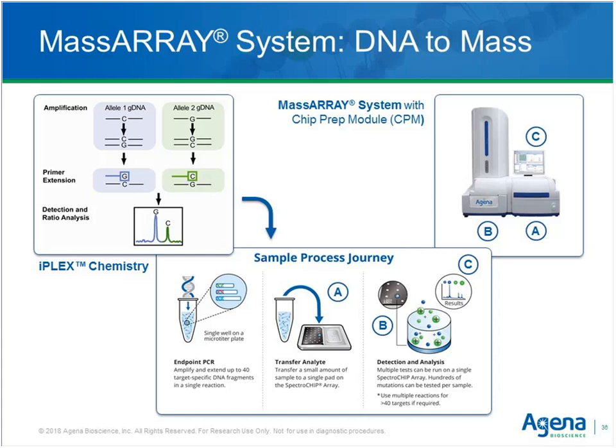The incorporation of either wild type or mutant, here symbolized by the G in blue or the C in green, results in reaction products of slightly different mass. The mass spectrometer is accurate enough to measure these differences and to accurately call the left reaction product the wild type and the green one a mutant.